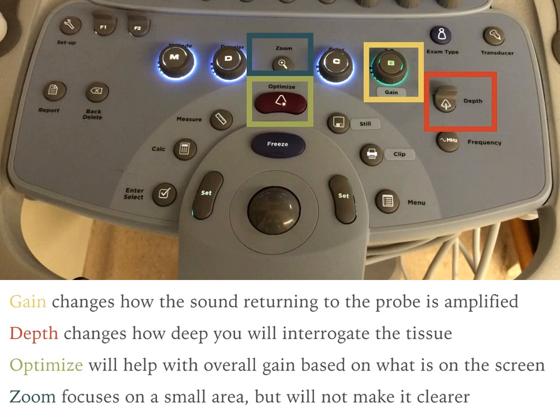It's best to tap the Optimize button to begin once you have the area of interest in your field of interrogation.